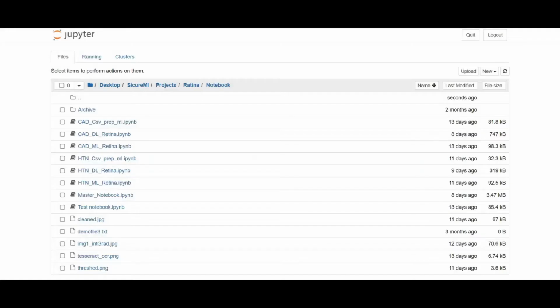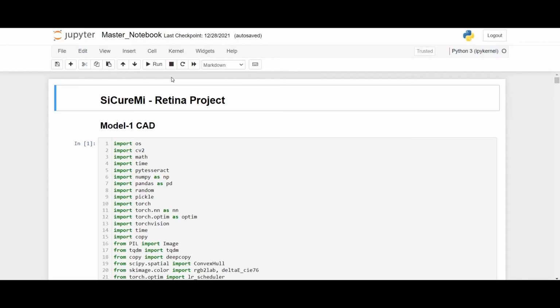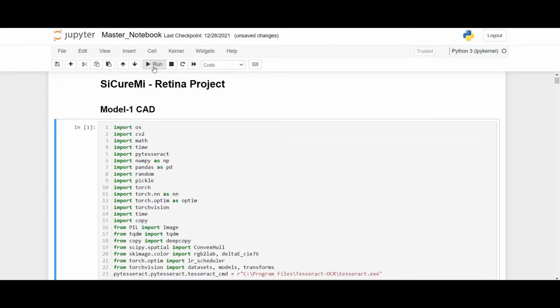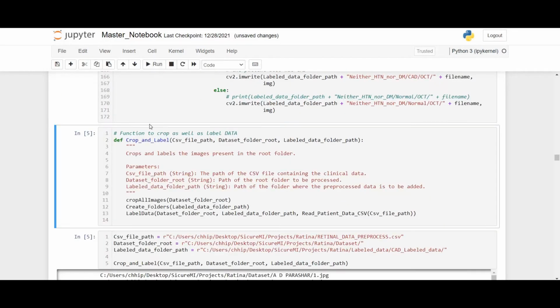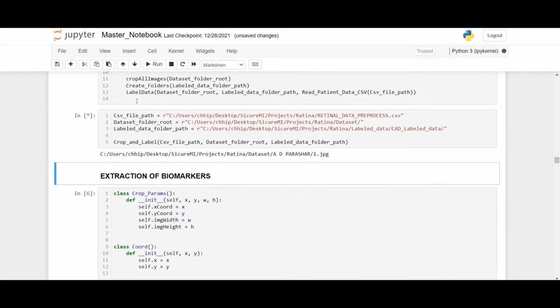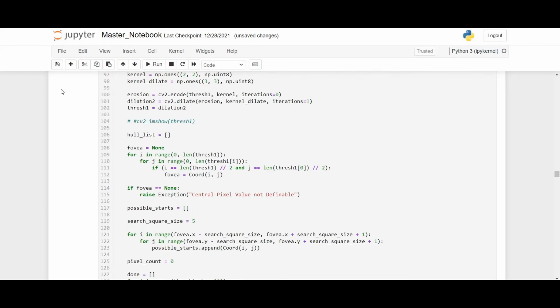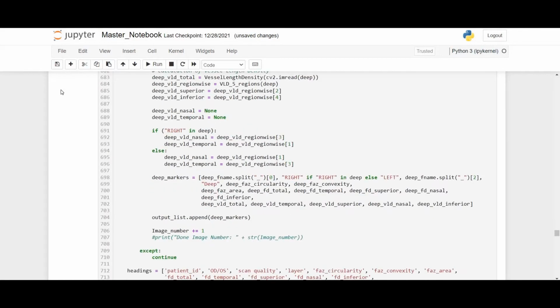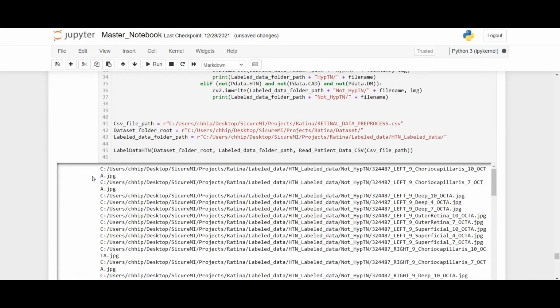Data preprocessing. Before starting running the code first, please make sure all the file paths given in all functions are correct. If these paths will not be correct, then it will throw us a file not found error. To start the data preprocessing, we are going to run the master notebook. First, we will import the libraries, then we are going to load the user-defined functions, then run the crop_and_label function to start cropping of the retina images. For the labeling, scroll down to hypertension model and run the labeling of hypertensive patients. After the labeling gets completed, we get images saved in the HTN_labeled_data in the labeled_data folder.